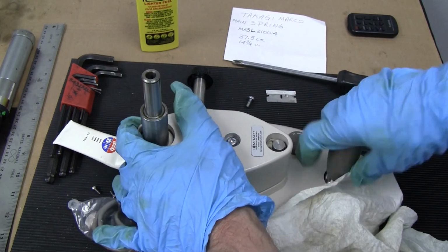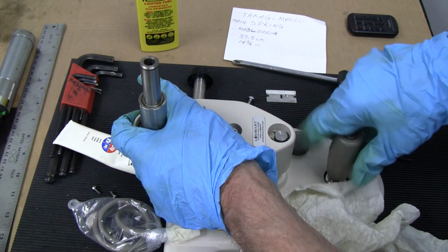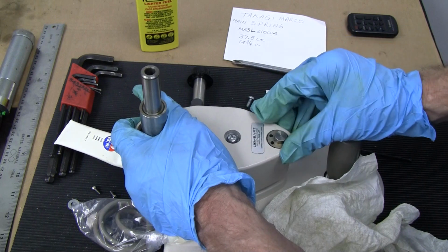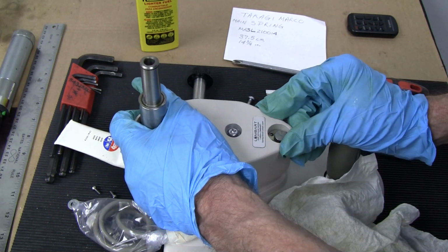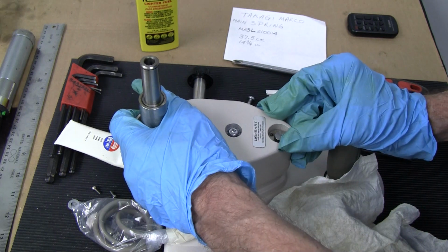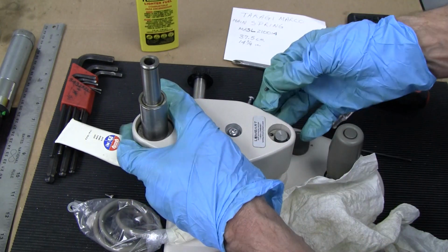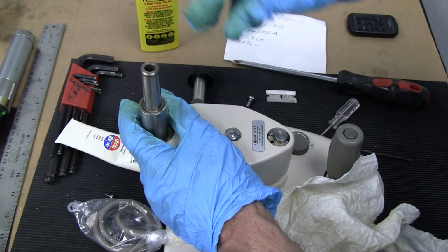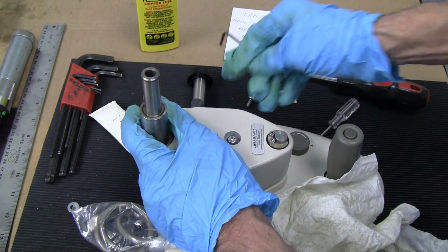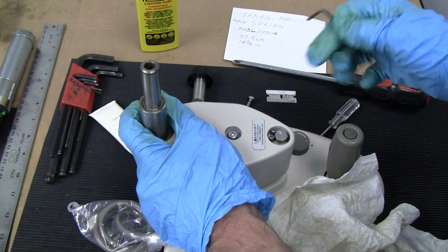Okay, snugging it down. I'm going to lift it up, and I can reposition this little keyway, and I might have to move the washer in and out to line up with those holes. So you may have to go a few times to line those holes up. And when it's lined up, you can put your screws back in. You could just lower it, drop your screws in once you have it lined up, and then slowly bring it up and start screwing your Allen screws back in.